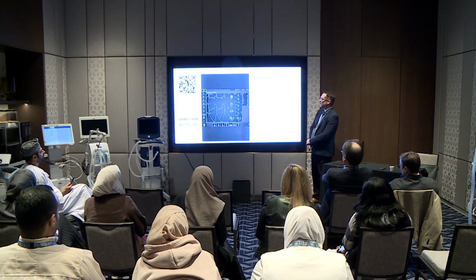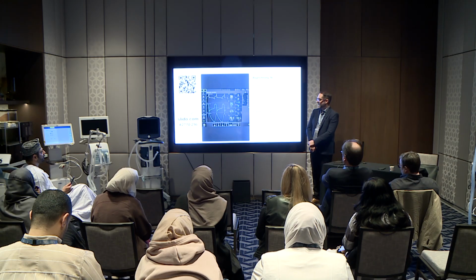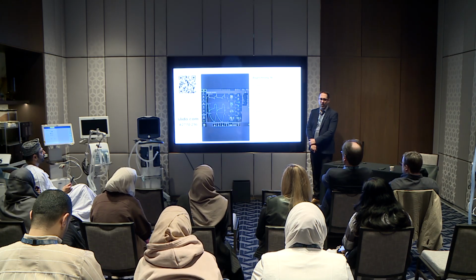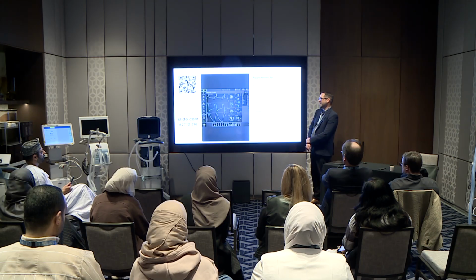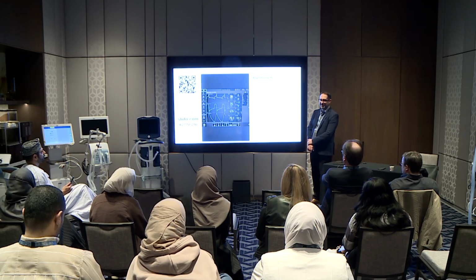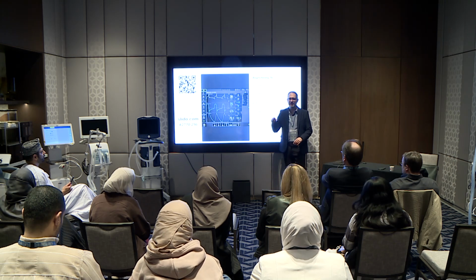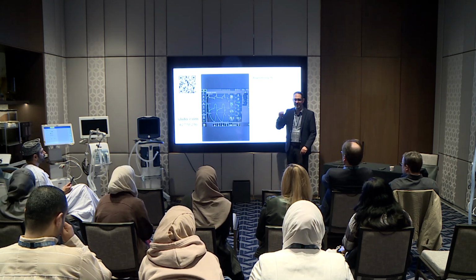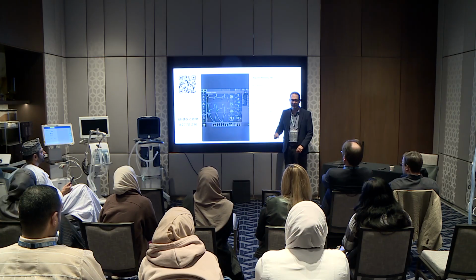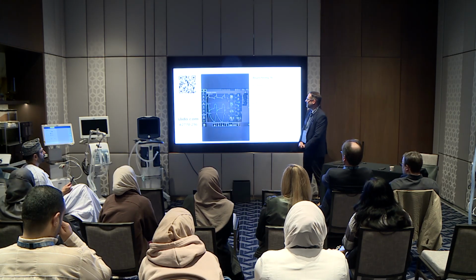And while you vote or walk through it, is the patient triggering the ventilator? Yes. So is it reverse triggering? No. Does it look like auto triggering? I would say it's very clear that the patient's making that effort. There's a huge drop in pressure. We have a large P0.1. With auto triggering, you'd have a very low, if not zero, P0.1, because your heart rate's not going to generate a huge pressure change at P0.1. So definitely not auto trigger.